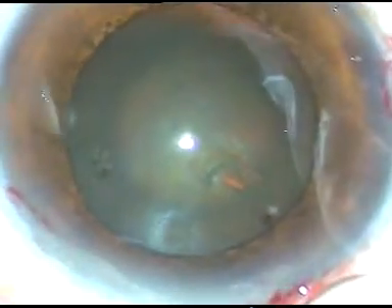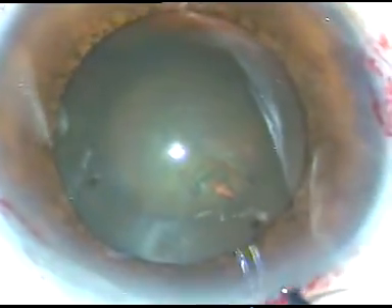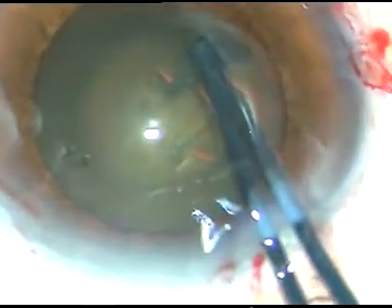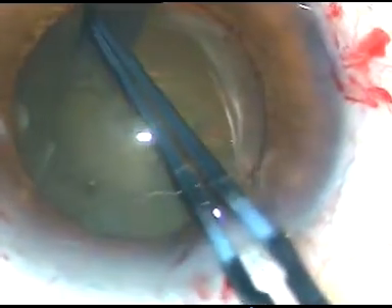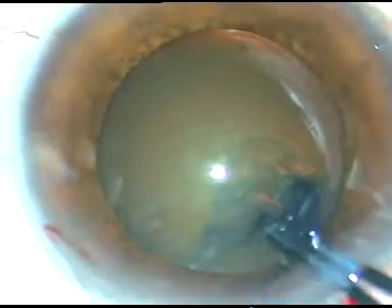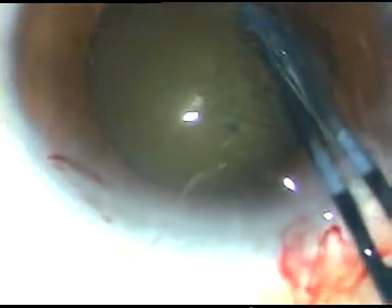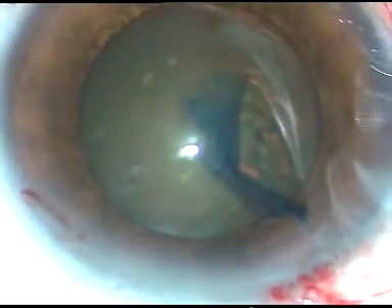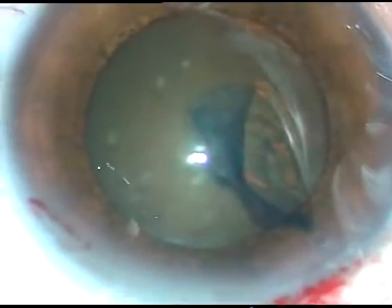The capsule has been incised and a capsular tag has been raised. I hold this tag with the utata forceps. In this case, I am going very close to the margin of the pupil to get an adequate-sized rhexis of about 5.5 to 6 mm. A nice round rhexis has been achieved.